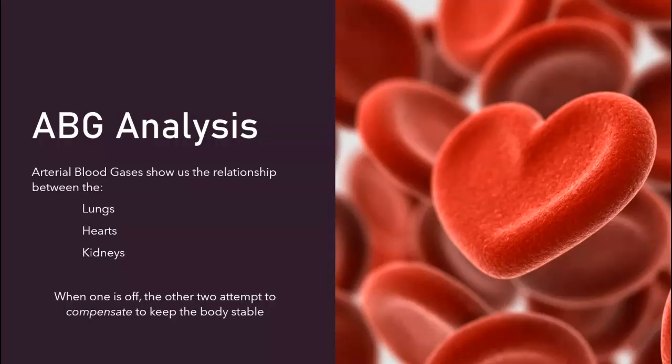All right, ABG analysis. So arterial blood gases, when it comes to any type of lab draw, any type of lab analysis, are our little bread and butter. And that's because it has to do with the relationship of the lungs, the heart, and the kidneys. These three organs are kind of the three best friends that troll around the body.